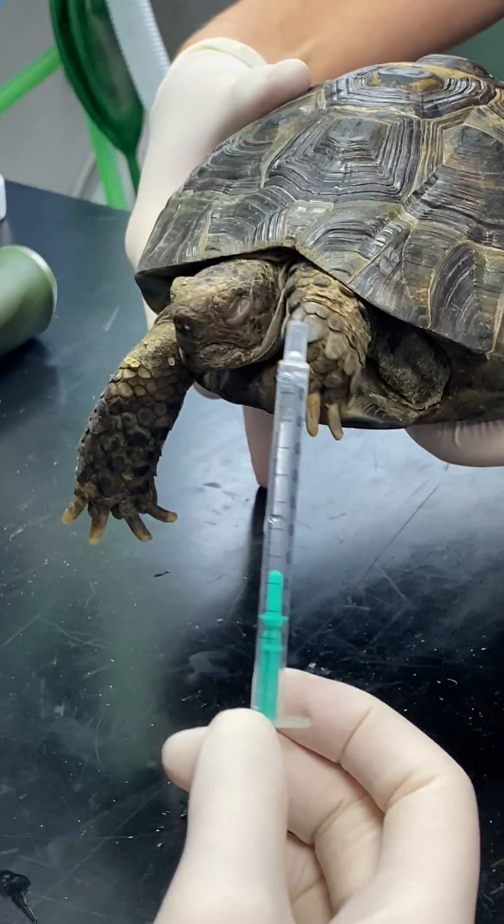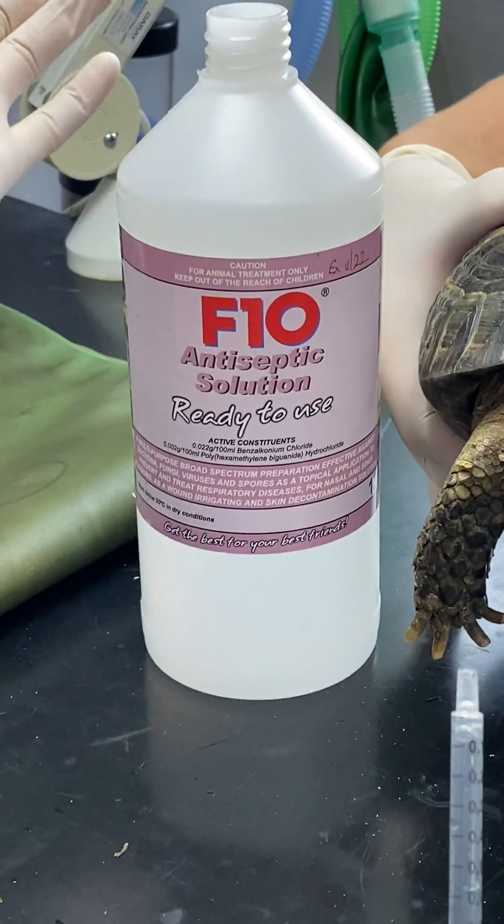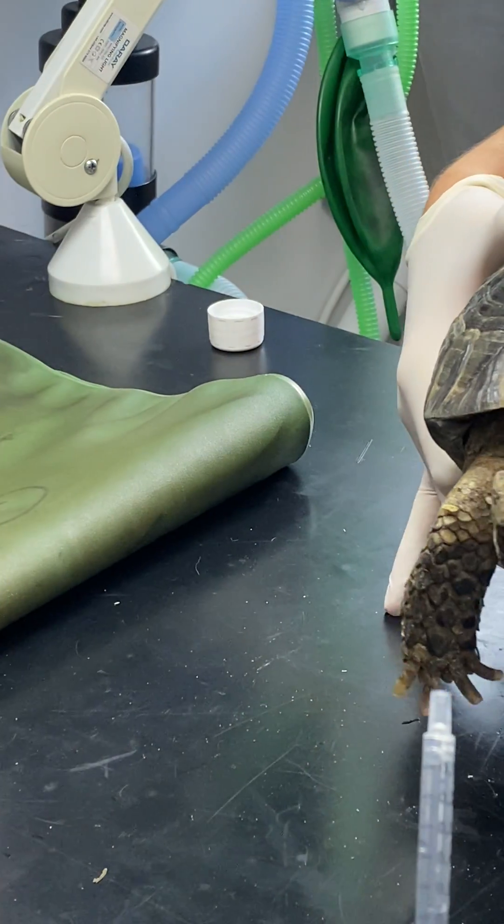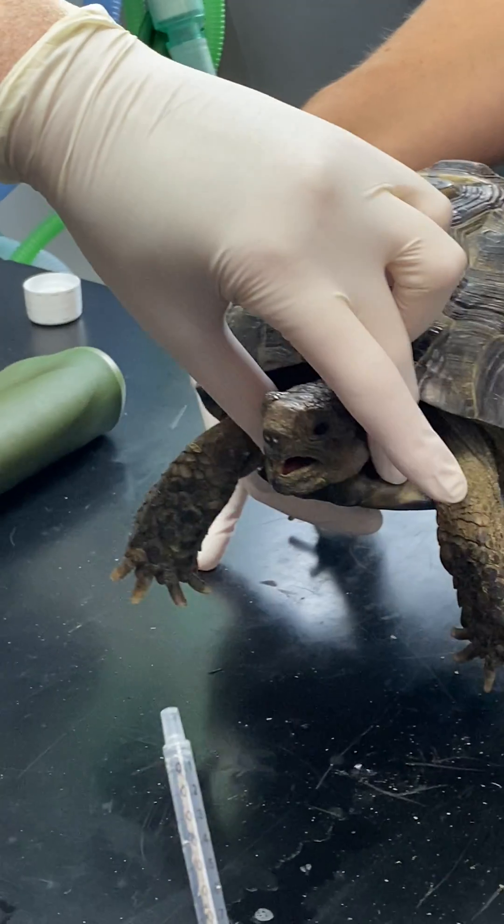This is a product called F10. We're using an antiseptic solution which is readily diluted already, but if you're using the super concentrated version, you want to do a 1 in 250 dilution.